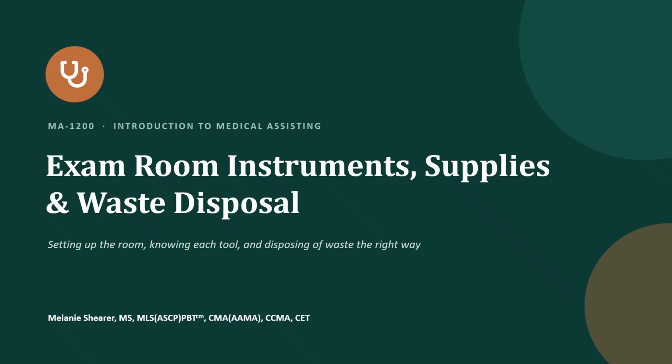You are the one who preps the room, anticipates what the provider will reach for, hands off the right instrument, and then cleans up and disposes of waste correctly afterward. By the end of this lecture, you should be able to walk into any exam room, name every instrument on the tray, explain what it's for, and confidently sort every piece of waste into the correct container.